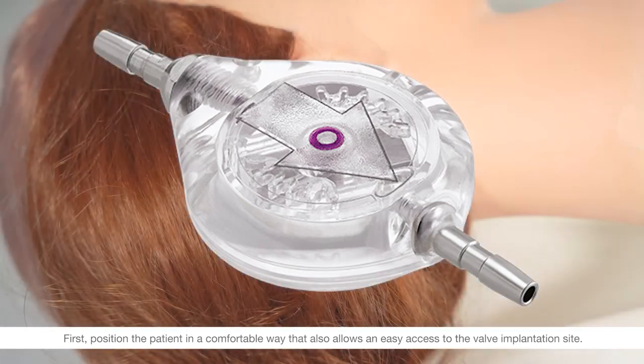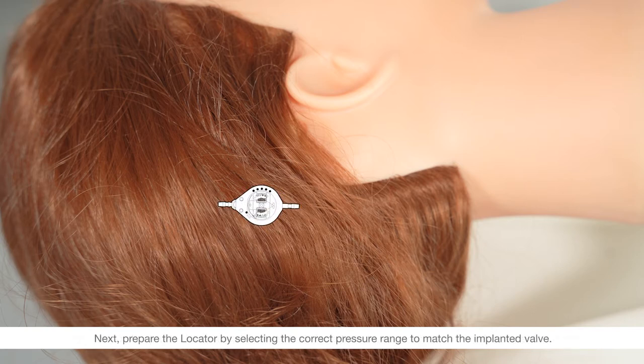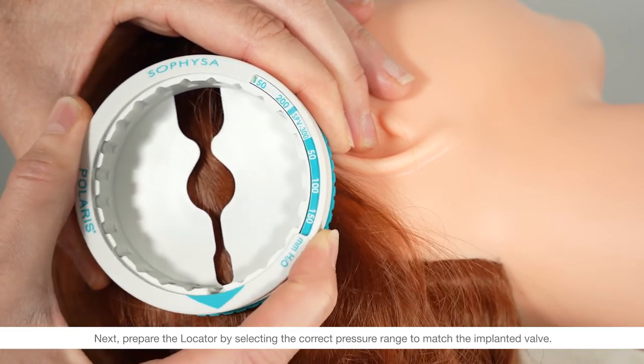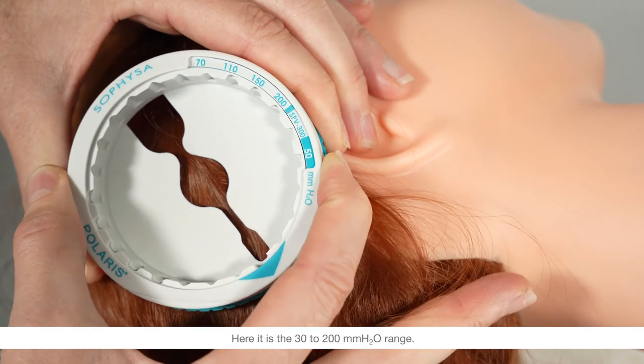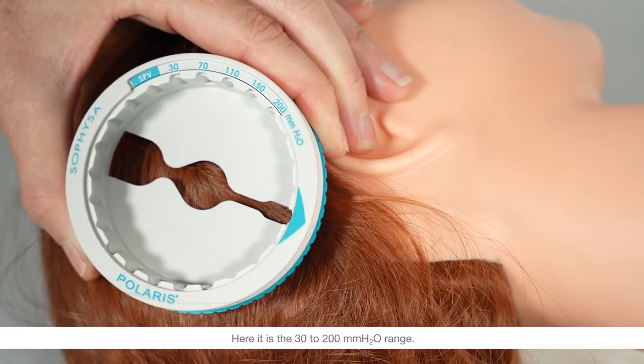First, position the patient in a comfortable way that also allows easy access to the valve implantation site. Next, prepare the locator by selecting the correct pressure range to match the implanted valve. Here it is the 30 to 200 millimeters of water range.